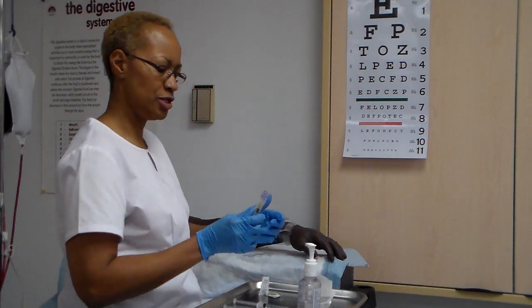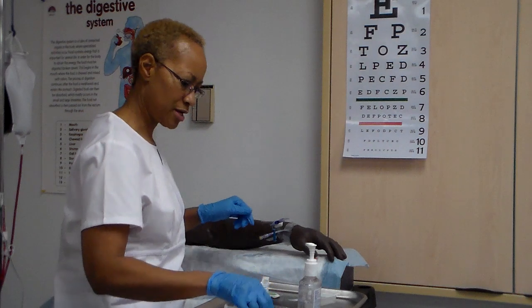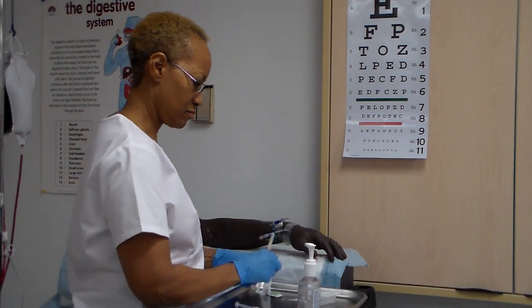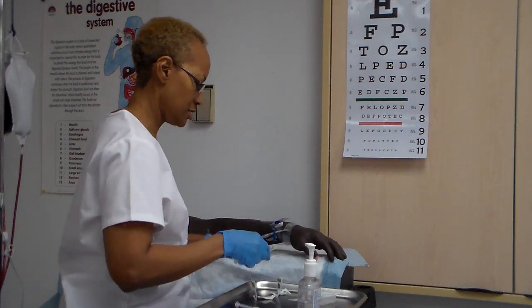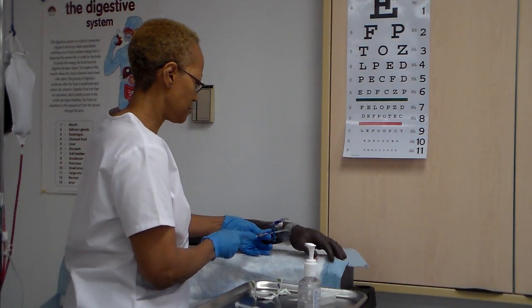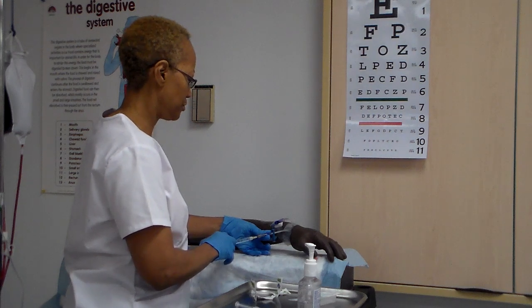I'm going to use a needleless system here. Okay, that's for my medication. Okay, I'm going to do saline in the center. Pull back, blood return.